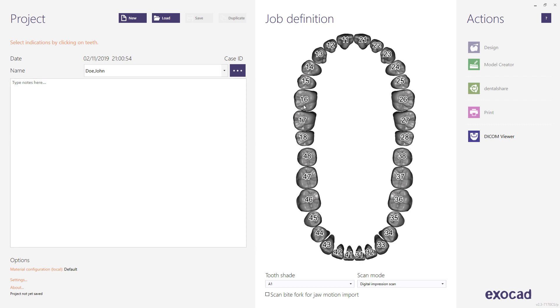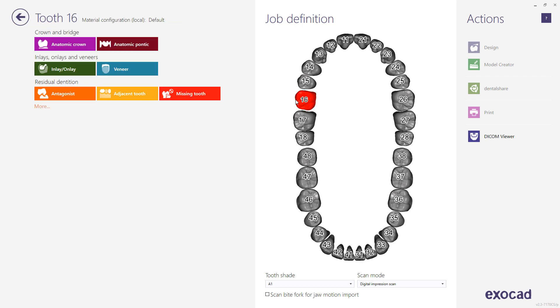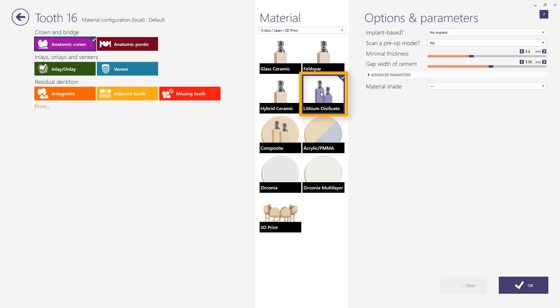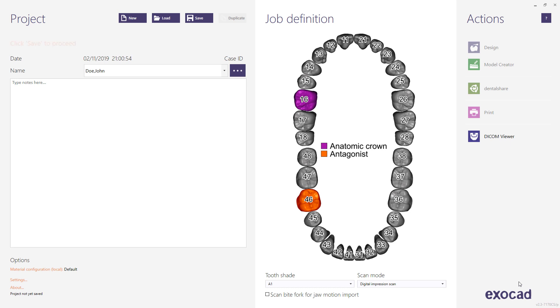Select the tooth number you wish to design. Select anatomical crown as a restoration type if you wish to create a full contour crown. The combination of anatomic crown and anatomic pontic will allow you to design an anatomic bridge or full contour with morphology. Designing a bridge will be shown in a separate video. Choose your desired material — in this case, for example, lithium disilicate. Finish the restoration definition by clicking the OK button.